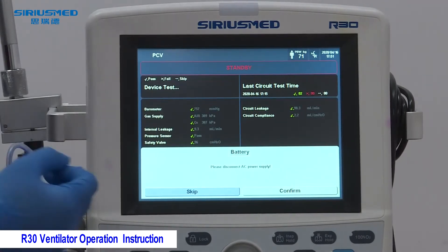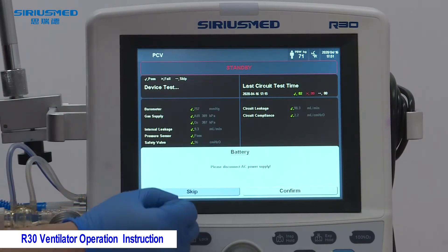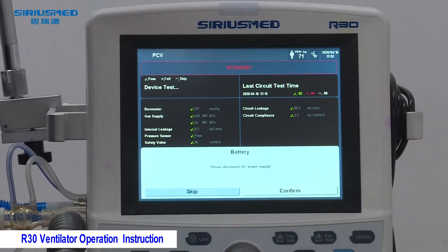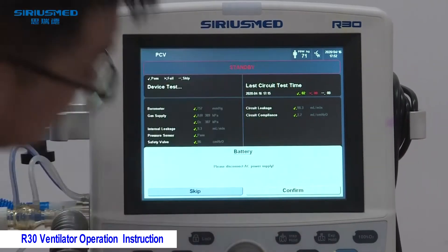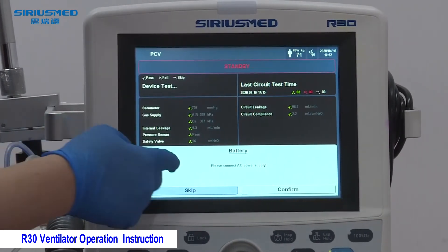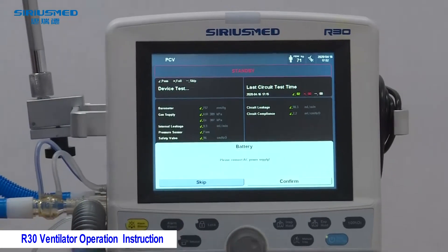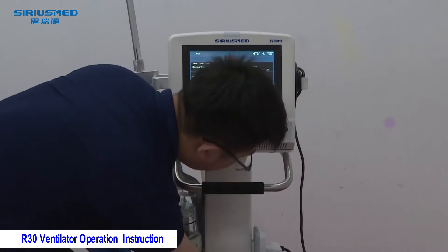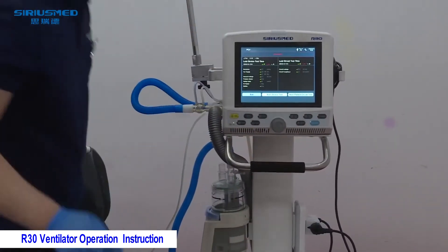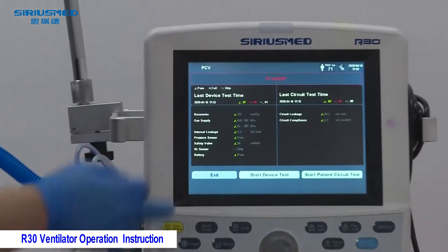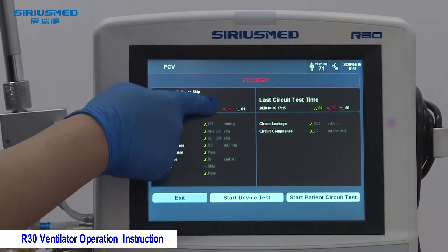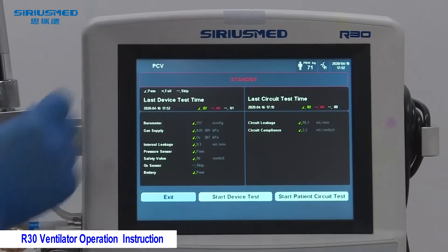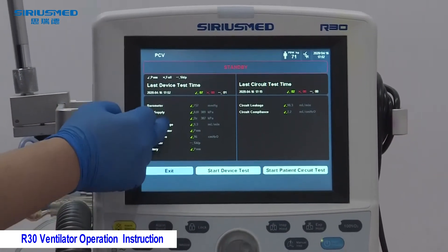There is then an instruction about the battery test: it tells you to disconnect the AC power supply, meaning you disconnect the main unit AC power cable. Wait a few seconds and then it will tell you to reconnect the AC power supply. After reconnecting, it will pass. The green indicator means the test passed, the red means failed, and the other indicator means skipped.